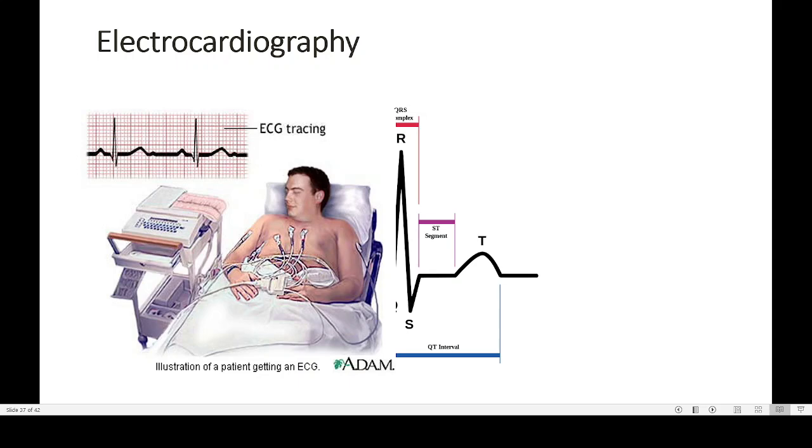By using an amplifier, this weak electricity will be multiplied or increased several times, so that it will be producing a visible pattern. Otherwise, it won't be producing a proper pattern. So in order to produce a very clearly distinguishing pattern, we are increasing the magnitude or amplitude of that current, increasing the strength of that current by using an amplifier. So here you can see what are the main parts of an ECG.